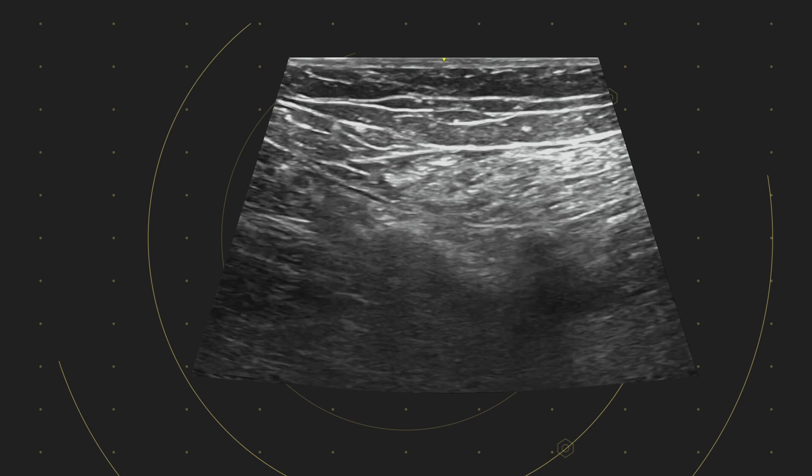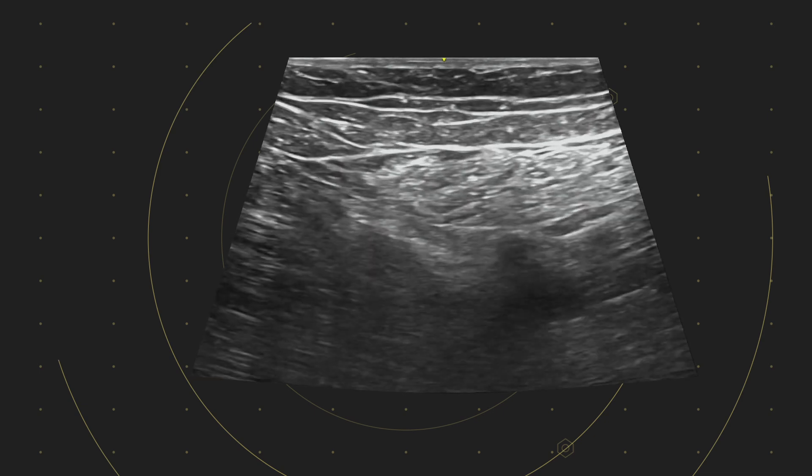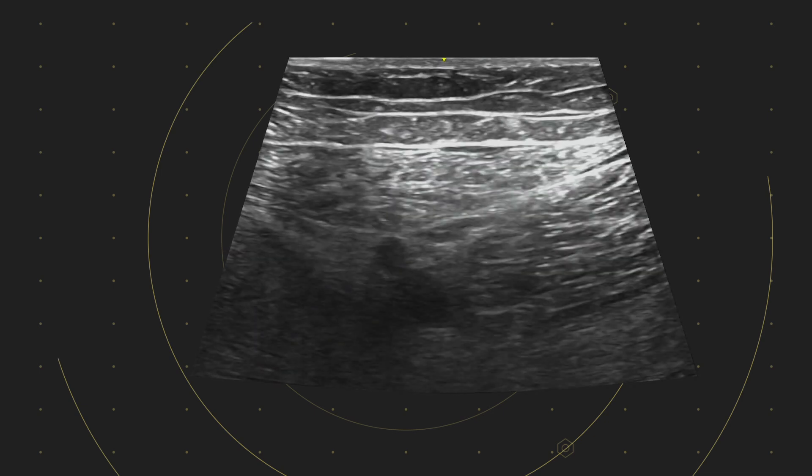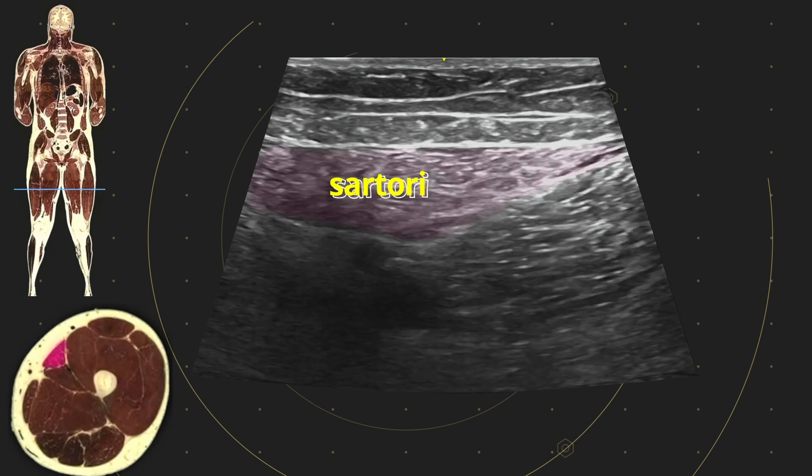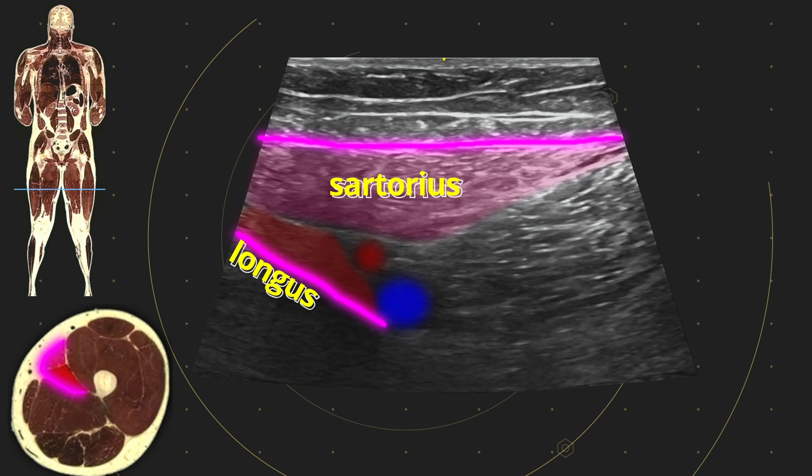This patient had some pathology which made the muscle anatomy look a little unusual, as you can see here. Here's what we're thinking: we've got sartorius here, superficial femoral artery under it. We've given a little poke on the probe to help confirm that this is the vein. We know our longus is here — we're at the apex of the femoral triangle. Vastus medialis is here.